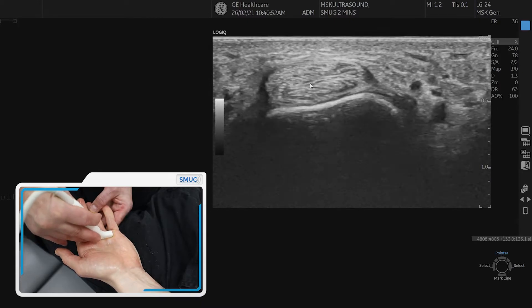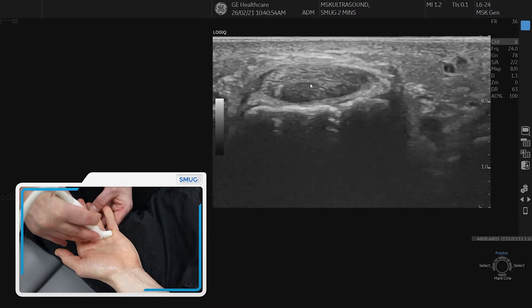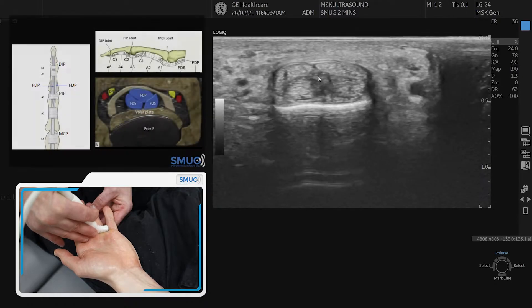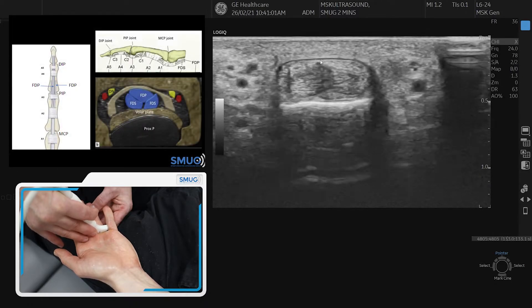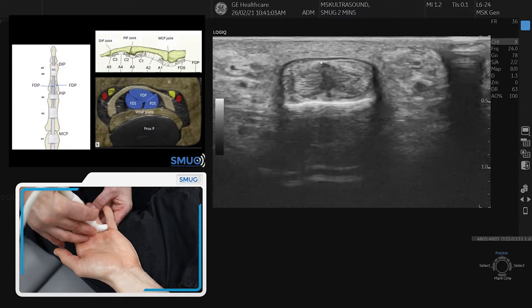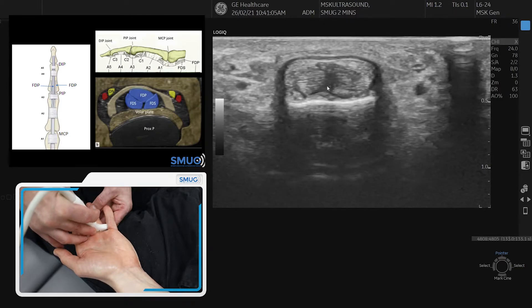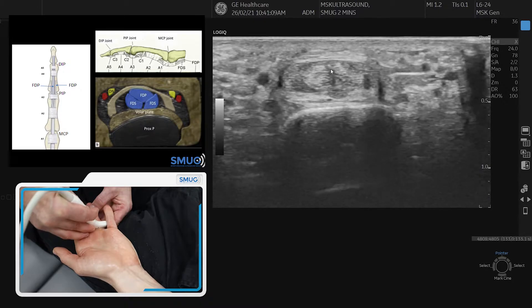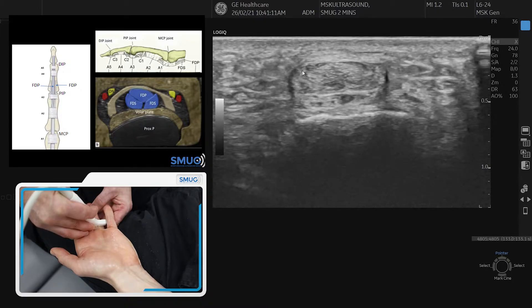Work it hard with your probe on the angle because it changes constantly. Now we're over the MCP and we're going to go to the second pulley coming up. If you then start looking into the tendons themselves, work it a bit harder with your probe to get good reflection — there's the profundus breaking through and the superficial tendons on either side of it.